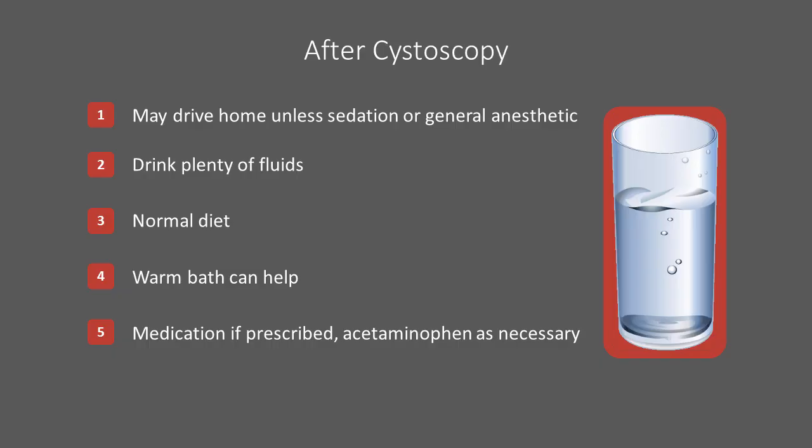Normally, you may drive home unless you have received sedation or general anesthetic. Once home, you should drink plenty of liquids, and you may resume your normal diet. If you experience discomfort, a warm bath can help ease this by relaxing the pelvic floor muscles. Depending on your situation, your doctor may prescribe medication for you. Otherwise, you should not need to take anything other than a mild pain reliever such as acetaminophen or ibuprofen.